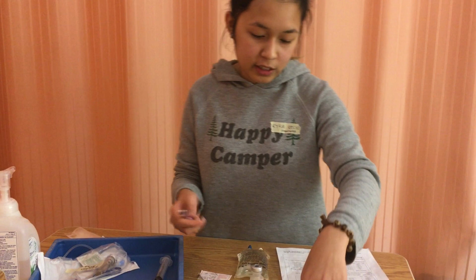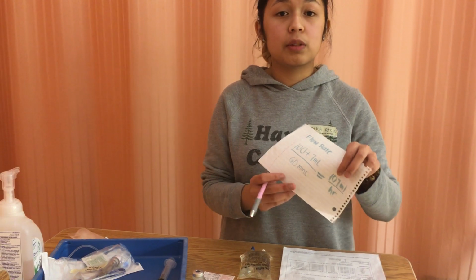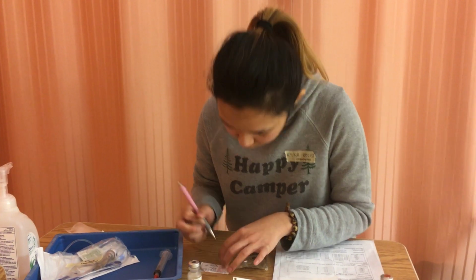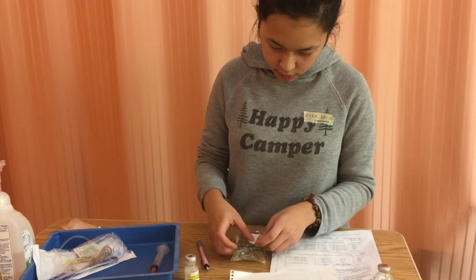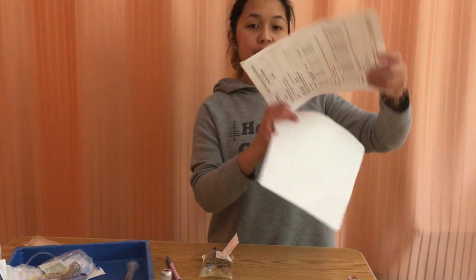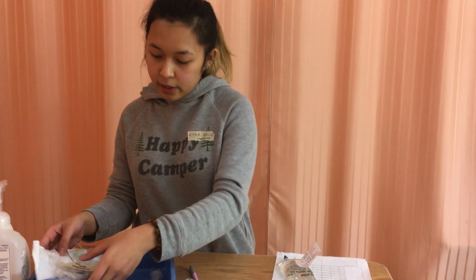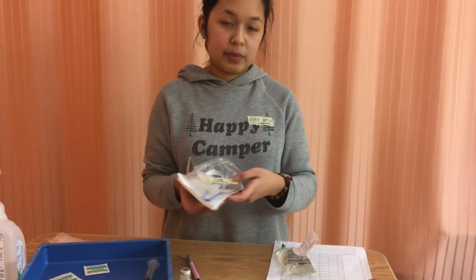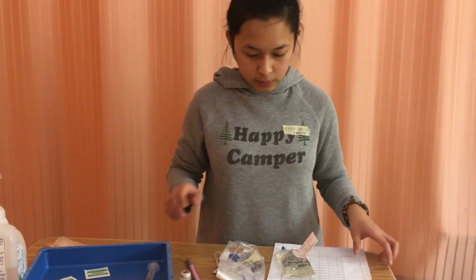I'm also going to calculate for the infusion rate, and I've calculated the flow rate to be 107 milliliters per hour, and I'm going to write that on my label as well. So now that I've done this, I'm ready for the bedside, and I'm going to grab my MAR, my mini bag, and alcohol swabs, as well as my secondary tubing, and the label for the tubing as well.